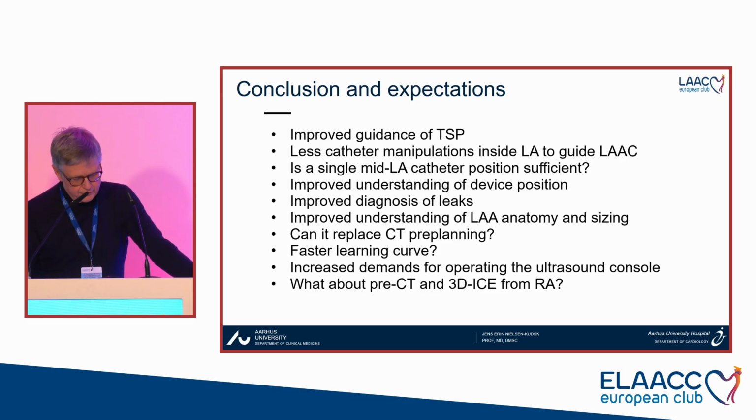We get an improved diagnosis of leak, improved understanding of LAA. Can we avoid, with this technology, CT pre-planning? I think that's something we should test in systematic studies. I think there will be a faster learning curve with this catheter compared to a 2D strategy.